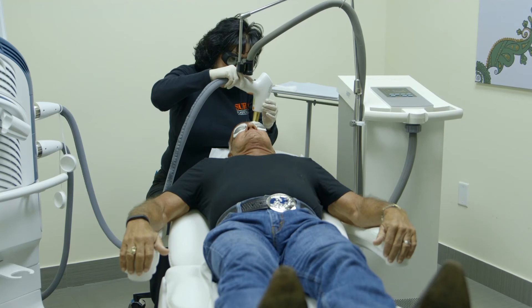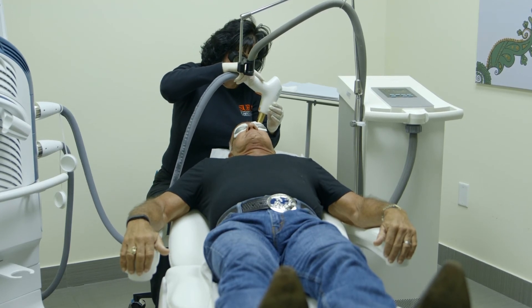The end result is having rejuvenated skin. You're looking more vibrant, more translucent, more youthful.